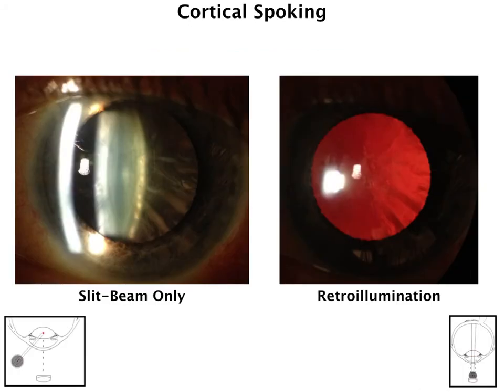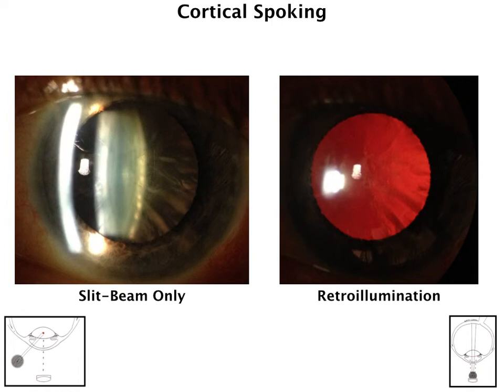Continuing down through the anterior chamber, let's talk about lens photographs. One of the most common types of cataracts is cortical spoking, and it's also one of the most interesting to photograph. The two best ways to photograph it are using a slit beam with just a little bit of diffuse illumination and retroillumination. The nice thing about a slit beam is that it gives you an optical cross-section of the lens, and you can see a little bit of the cortical spoking. But with retroillumination, you can really see the full extent of the cortical spoking and how it's progressing into the center of the lens, therefore probably significantly affecting the patient and most likely causing glare issues as well.